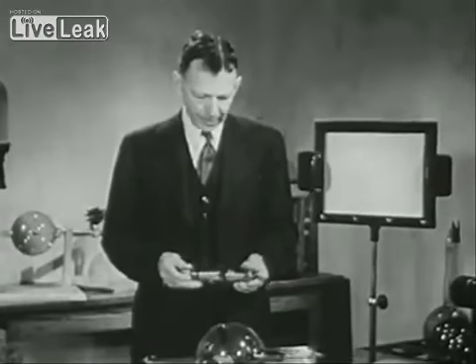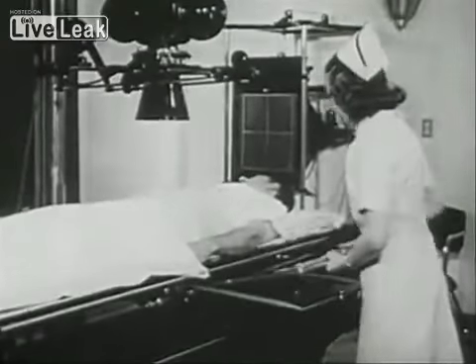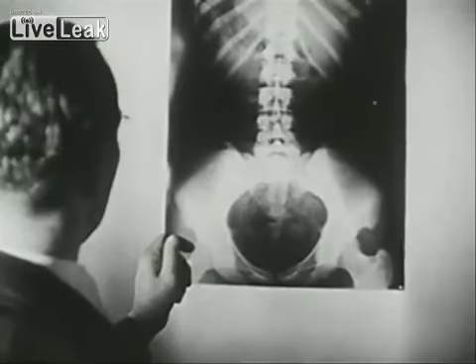As a matter of fact, X-rays are like ordinary light, except that they are of a very much shorter wavelength and are therefore invisible. Although X-rays themselves cannot be seen, their effects can fortunately be made visible. Photographic film in general is sensitive to X-rays, and a special type of it is used to record their presence. Recording of X-ray images on film is called radiography, and the finished films are known as radiographs.